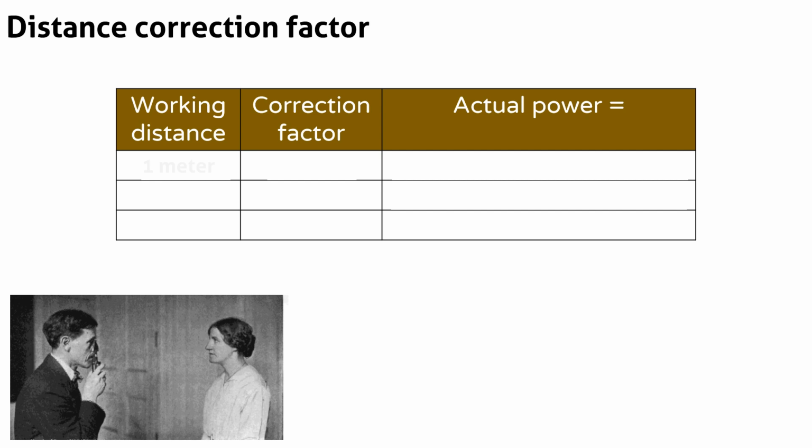And so, for a working distance of 1 meter, the correction factor is +1, which is subtracted algebraically from the lens power that gave neutrality on retinoscopy. So the refractive power of the eye is equal to lens power minus +1. You can also say a correction factor of -1 is added to the lens power. You may use whichever terminology you are comfortable with.